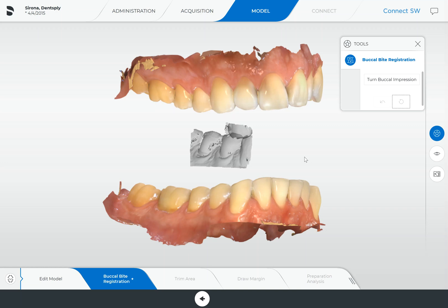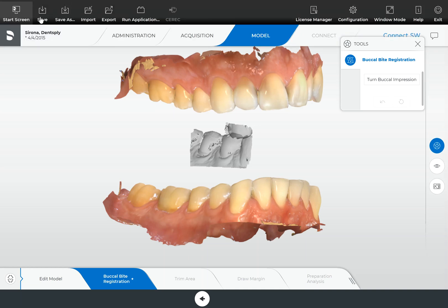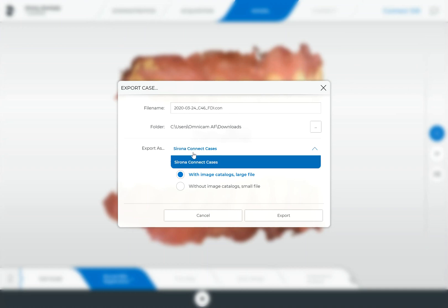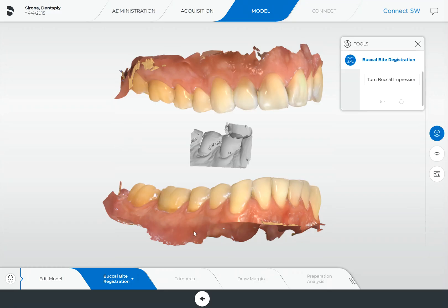A lot of times this happens when there's a lot of artifacting in the scan, and so I just wanted to review how we actually correlate these models. Because right now, since they're not correlated, we can't send them off to any sort of laboratory. Also, we can't export them as any usable file type at this point. So we need to make sure that these are correlated to have a good buccal bite registration before we can actually move forward and do anything with this scan.